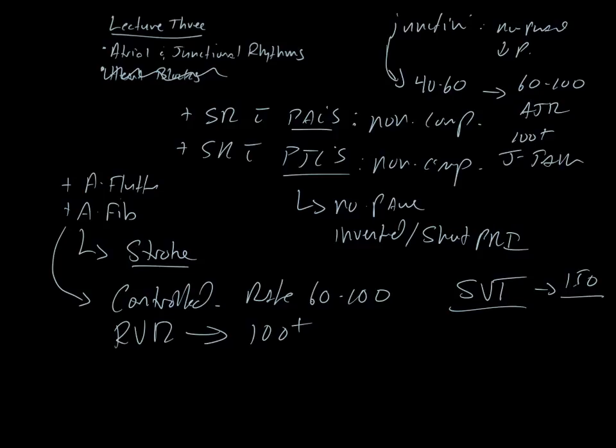All right. Yeah, what you got? Going back to that one strip we had, if AFib is less than 60, does that assume that it is dissociated? No, not necessarily. If it is less than 60 and the ventricular rhythm is regular, then you're looking at AV dissociation. Because if the AV node was actually working, it would be irregular, right? Because it wouldn't be blocking them all out. Good question. You guys okay there?